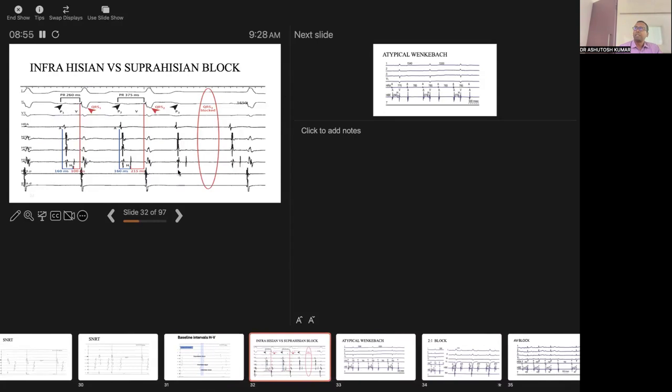See, this is bad. And the reason is whenever you are getting H and followed by there is no QRS, you can say infrahisian block. Infrahisian means you have already damaged the his. The next escape is ventricle. So ventricular escape is not a reliable escape. The patient can escape. So this is very difficult. Difficult means the patient is having a bad AV conduction disorder, or if you are doing ablation, it has happened, means patient has to go for urgent pacemaker.